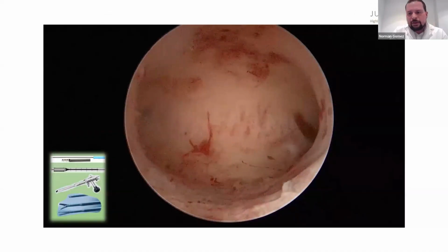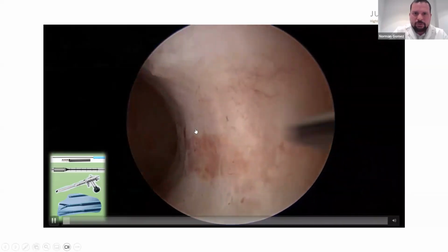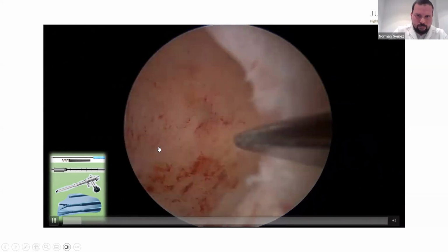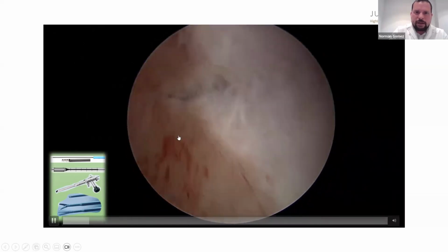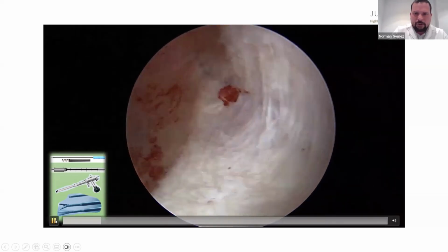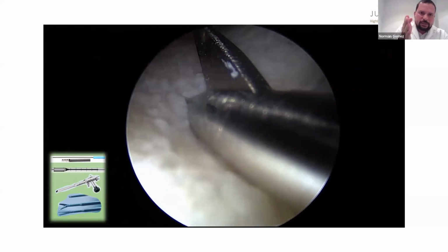This is a good example of how to combine instruments. Sometimes, if you have a lateral fibroid, you need to open the lateral wall of the uterus to approach this particular case, because you must know that the instruments are straight.